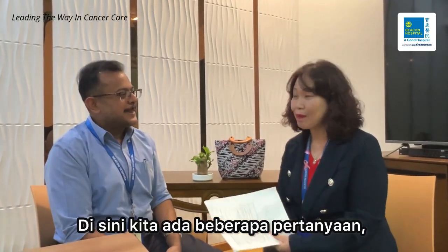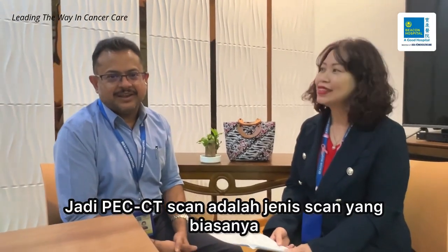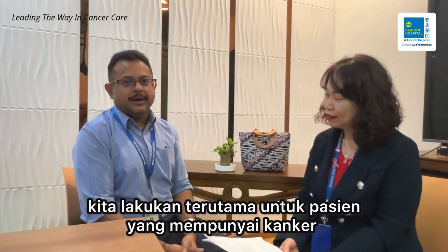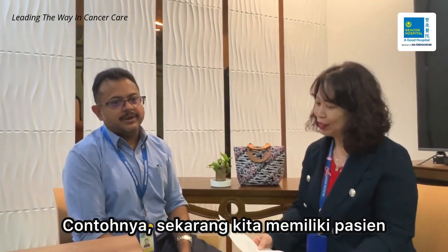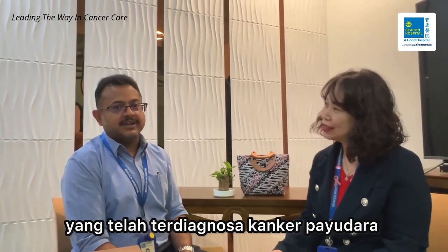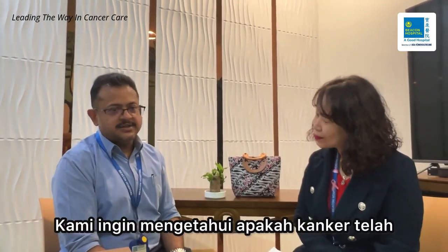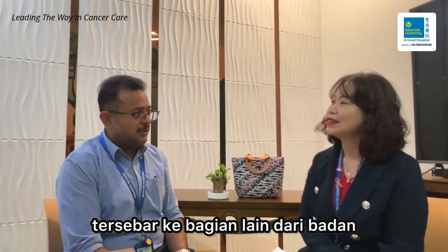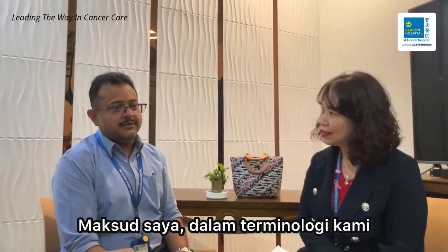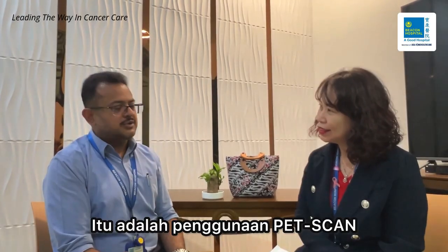Di sini kita ada beberapa pertanyaan, apa itu PET CT scan? So PET CT scan is a type of scan that we usually do mainly for patients with cancer. For example, now you have a patient diagnosed with breast cancer or colon carcinoma, bowel cancer. We want to know whether the cancer has spread to other parts of the body. So meaning to say, in our terminology, we call it staging scan. So that is the use of PET scan.